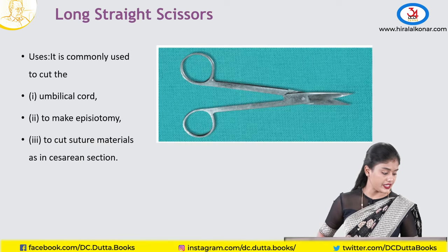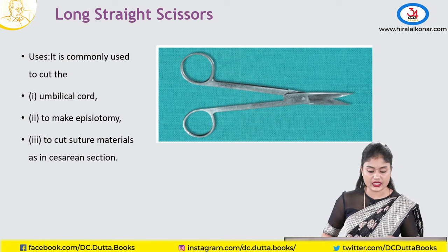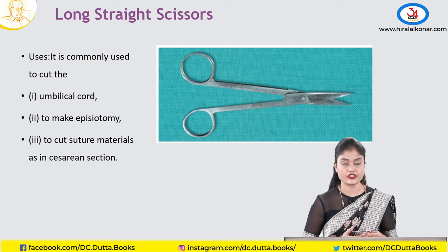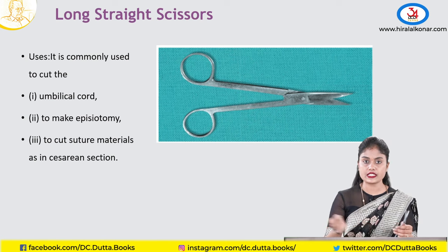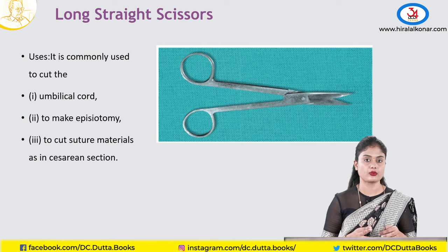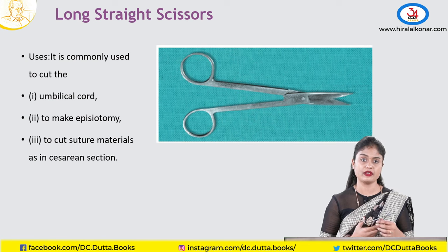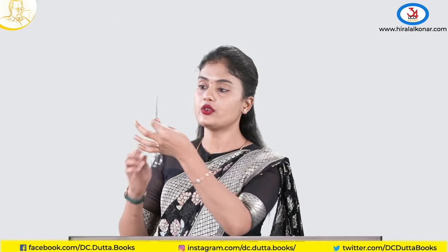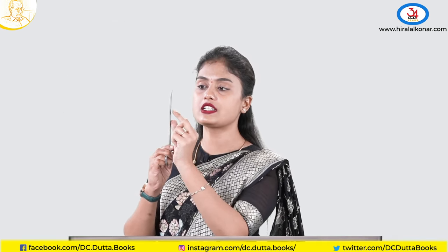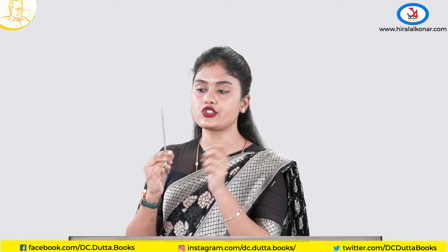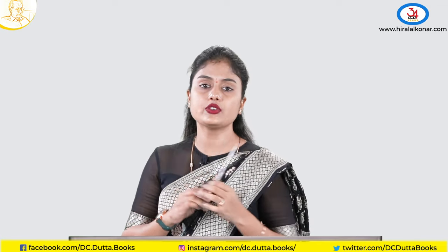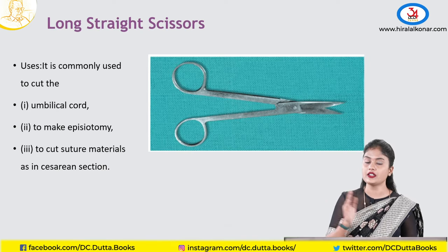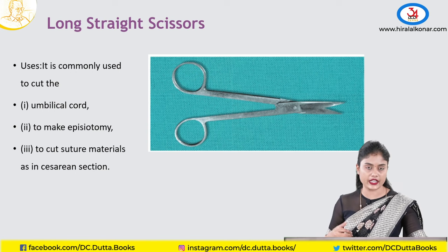Coming to the long straight scissors — also called Mayo scissors. This is used to cut tissues like the umbilical cord or any tissue. If episiotomy scissors are not available, this can be used. Curved scissors are used for skin or tissue cutting, whereas straight scissors are used for cutting suture materials.